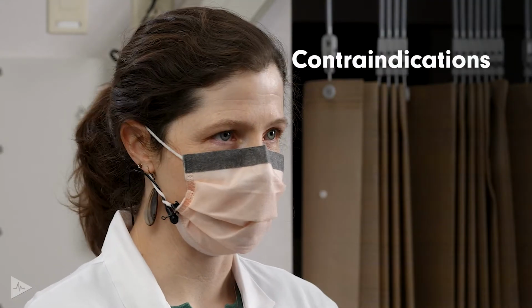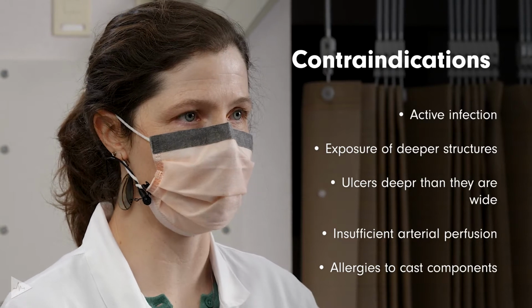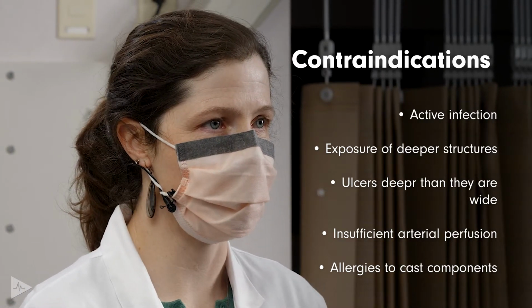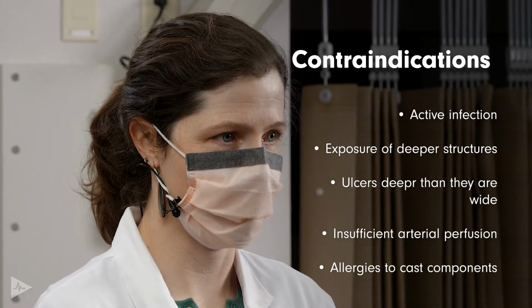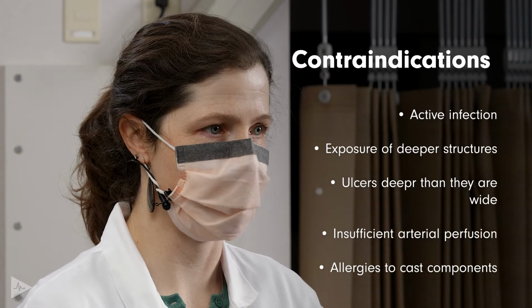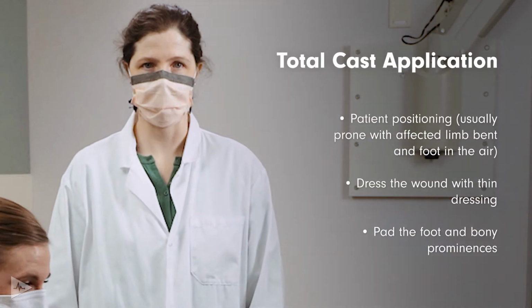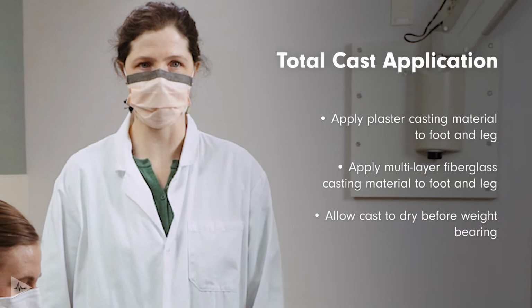We do not want to apply a total contact cast if we have an ischemic limb, if we have any exposed deeper structures such as bone or tendon, if the ulcer is deeper than it is wide, and if we have any active infection. So these are components that will need to be reevaluated at every cast application. This is a brief overview of how the total contact cast is applied for your reference, and we will go through this step by step in the demonstration.